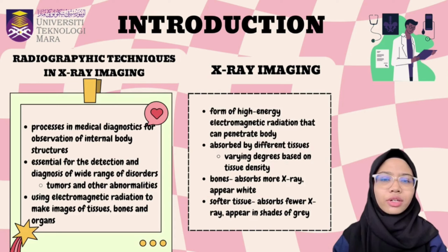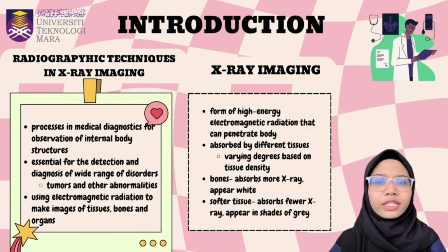Using electromagnetic radiation to make images of tissues, bones, and organs is the fundamental idea behind X-ray imaging. X-rays are a form of high-energy electromagnetic radiation that can penetrate the body. When X-rays pass through the body, they are absorbed by different tissues at varying degrees based on tissue density. Bones, being dense, absorb more X-rays and appear white on the radiograph. In contrast, softer tissues absorb fewer X-rays and appear in shades of grey, while air-filled spaces appear black.